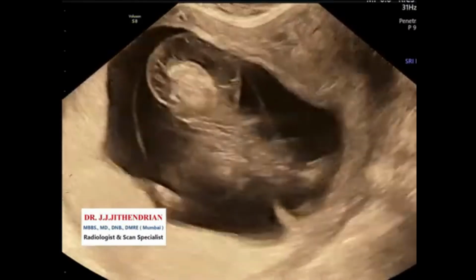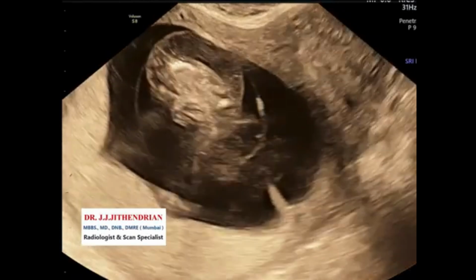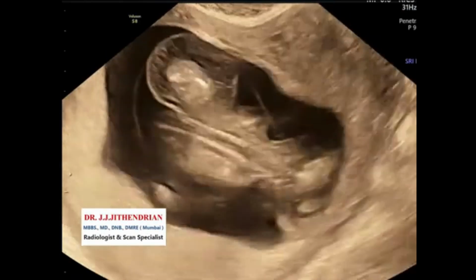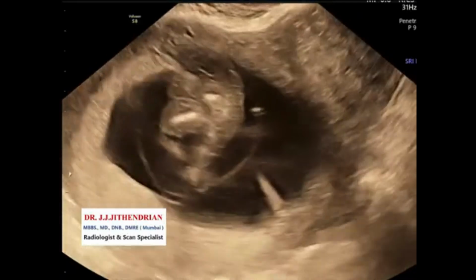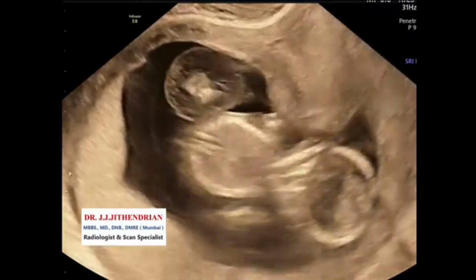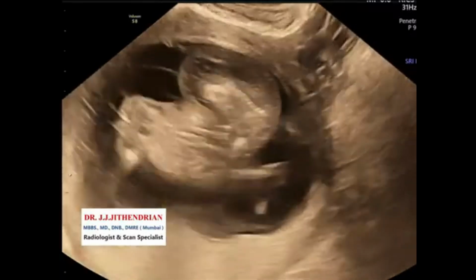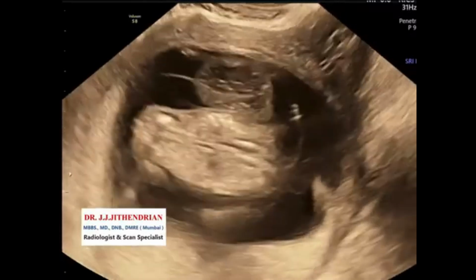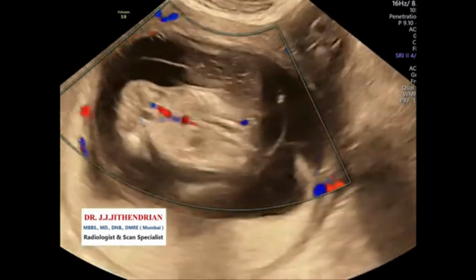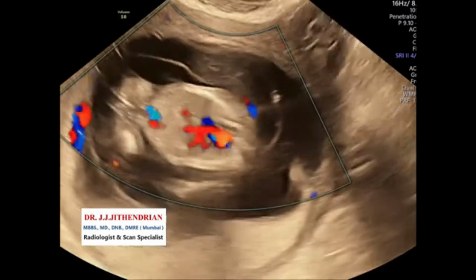The images and the video show two different twins. One looks normal sonographically, with its CRL of 6 centimeters corresponding to 12 weeks 3 days. The other twin looks odd, with absence of the head and upper limbs. It also shows severe hydrops around it. Its CRL including the hydrops measures 3.3 centimeters, corresponding to 10 weeks 1 day.